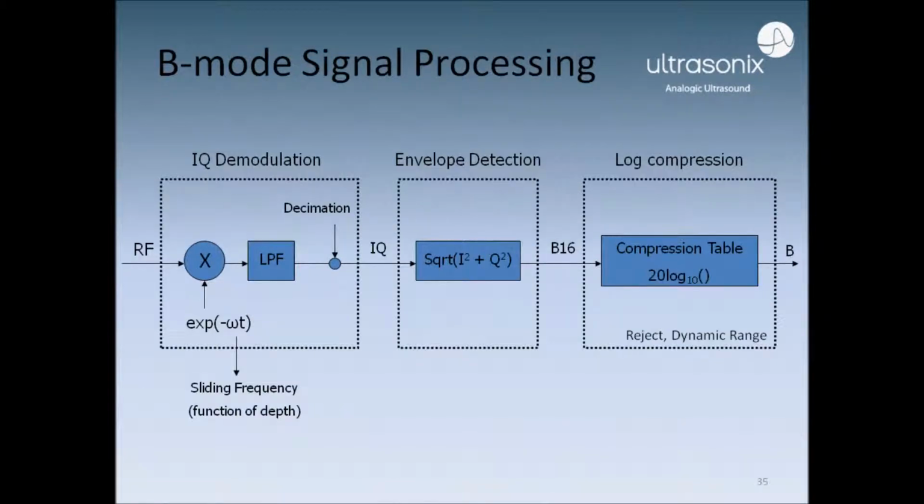In the next couple of slides, I will go over the block diagrams of the signal processing pipelines for different imaging modes. I start with the pipeline for B-mode imaging. Note that these pipelines correspond to version 6.x of our software. The 5.7.x and prior versions did the envelope detection inside the hardware. You can find more historical data about these systems on Wikisonix. The Ultrasonix hardware acquires beamformed RF data and transfers them to the memory of the PC. All the other processing steps are carried out by the Ultrasonix software inside the CPU.